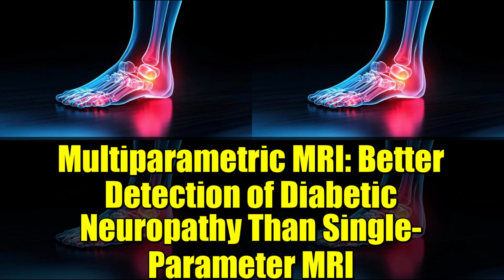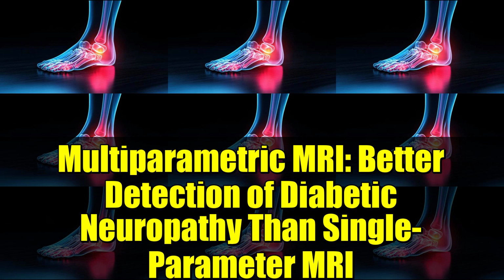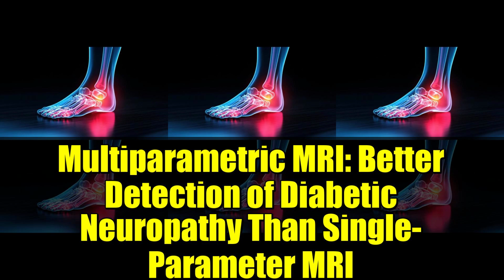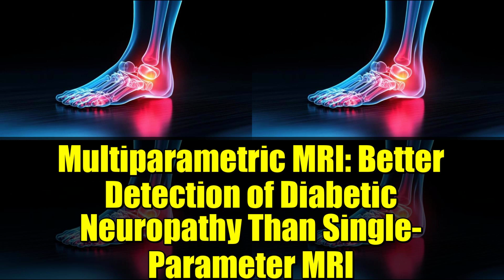Dr. Oh's takeaway is clear. By merging fractional anisotropy, a structural marker, and T2 relaxation time, a pathological marker, we achieve the highest diagnostic accuracy. This approach not only promises earlier detection, but also opens the door to more personalized and effective treatment strategies.